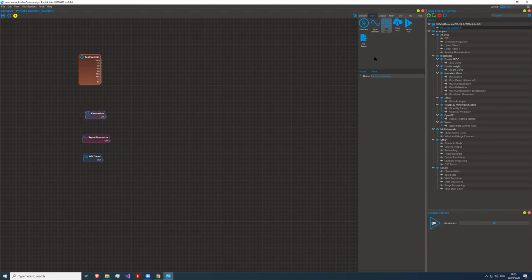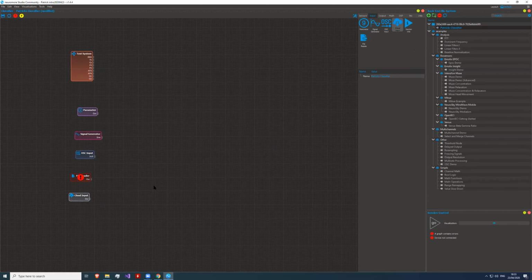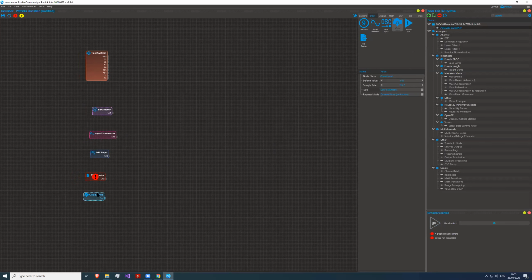So those are some of the input nodes. There's also a file reader, so you can read in comma-separated files and EDF files. Feel free to extend it to a file format you want to see and don't see yet. We have a cloud input, which is a nice way, because all those classifiers can write data to our cloud if you expressly want that.